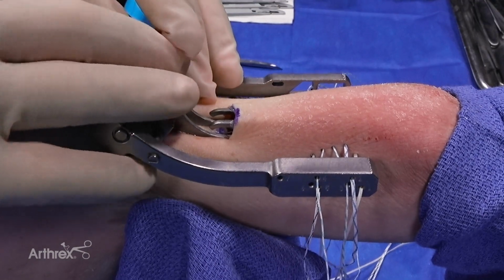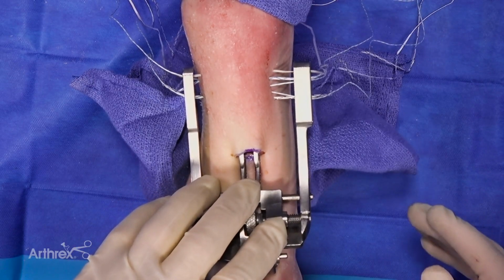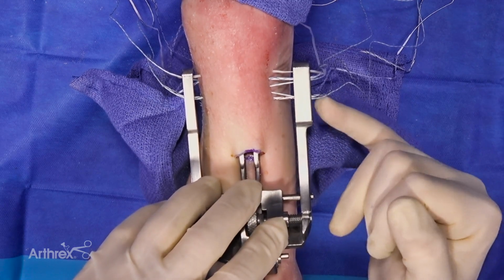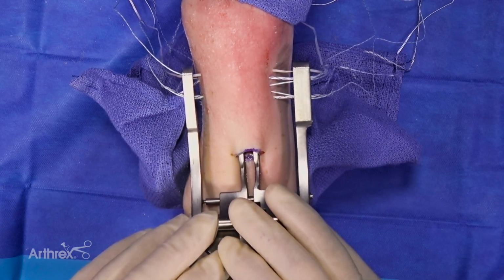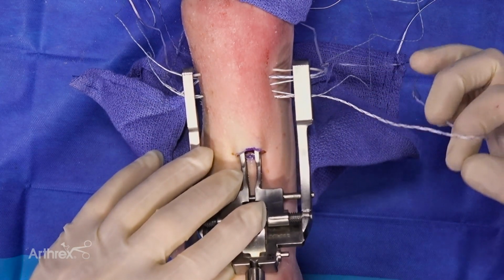I don't think you have to do it in all patients, but I like to do it in my elite athletes who are going to be a little more vigorous with their rehab program. If I do use position 6 and 7, I typically would have 2 FiberLink looped sutures that I place in both those holes to then utilize number 5 as a lock suture.